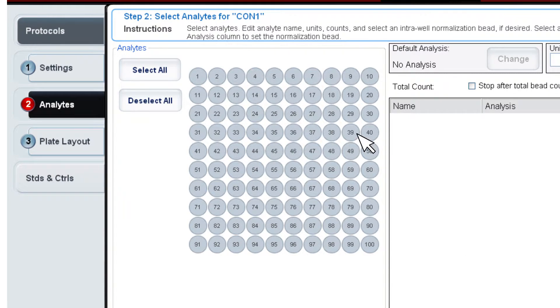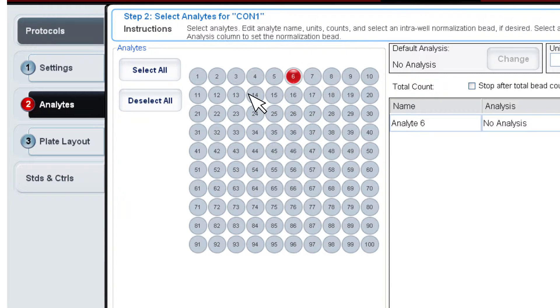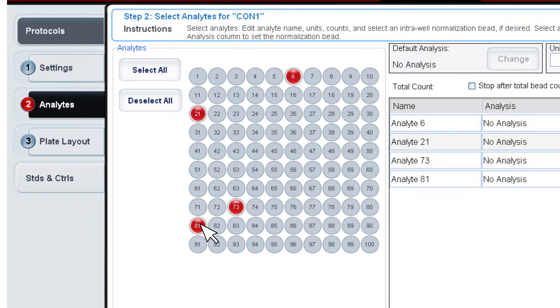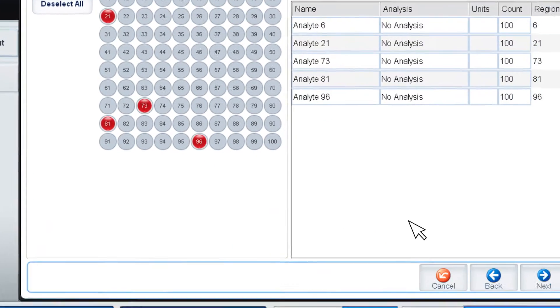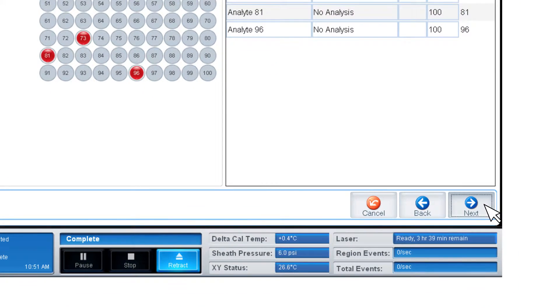Select regions 6, 21, 73, 81, and 96. Click Next.